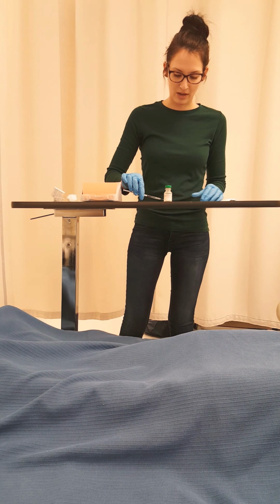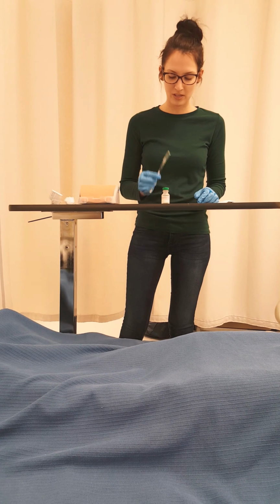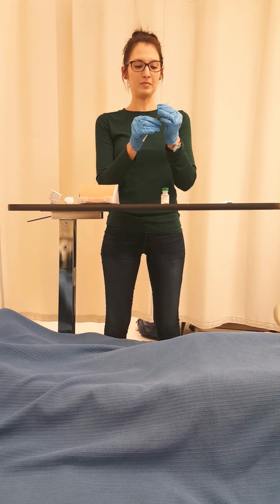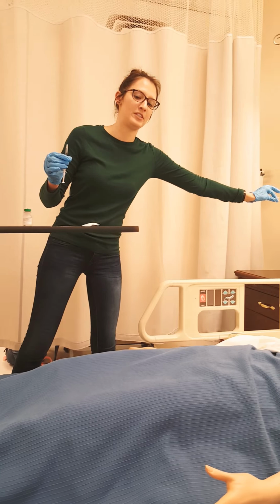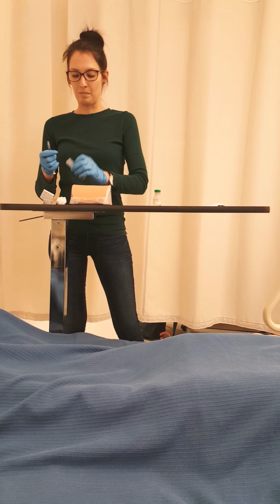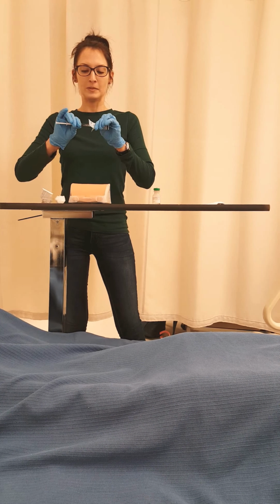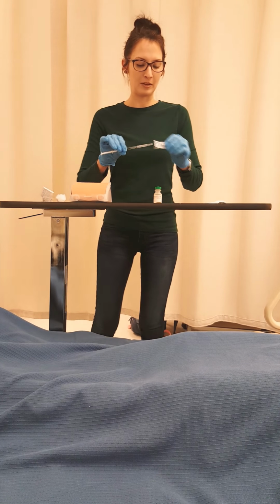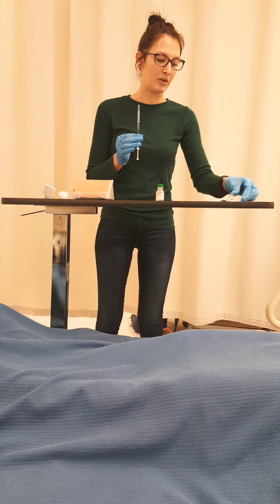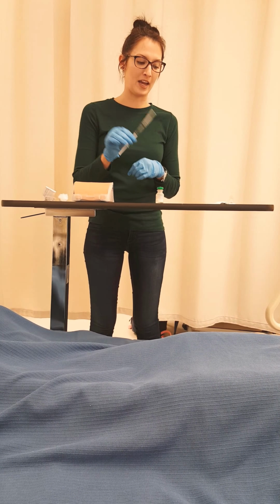I'm going to recap my needle using the one-handed scoop method for safety. And I'm going to remove this needle. I'm going to place it in the sharps container. I'm then going to put on a new needle that is of appropriate gauge and length. And I'm going to label this injection with the appropriate information for safe transport to our patient's bedside.